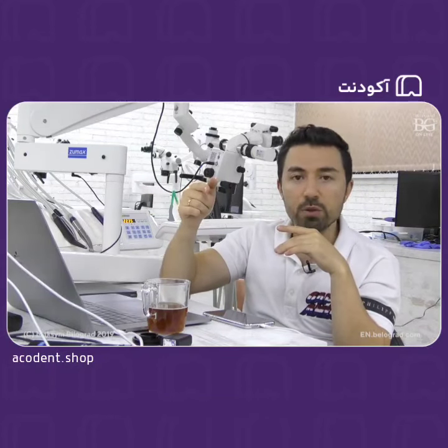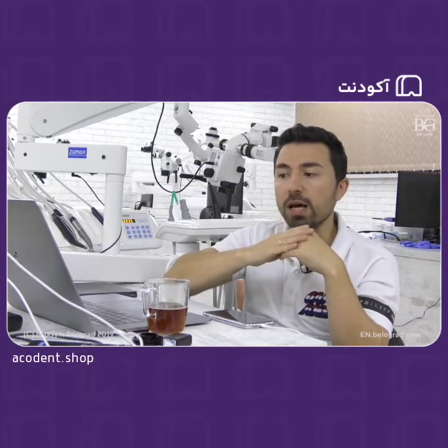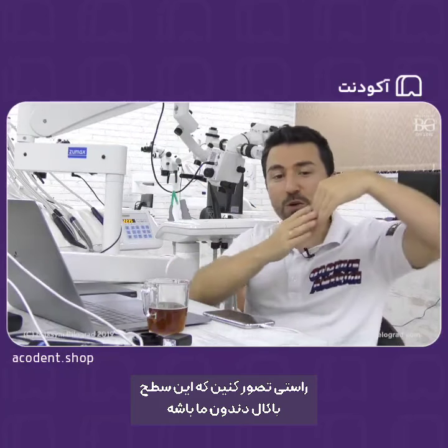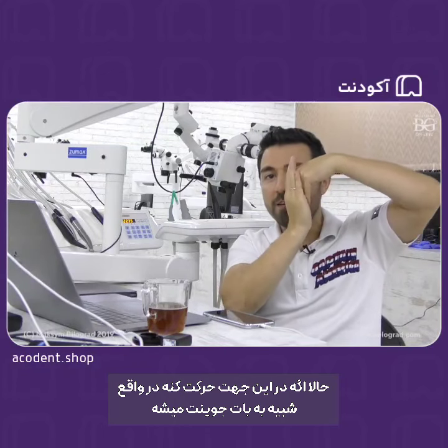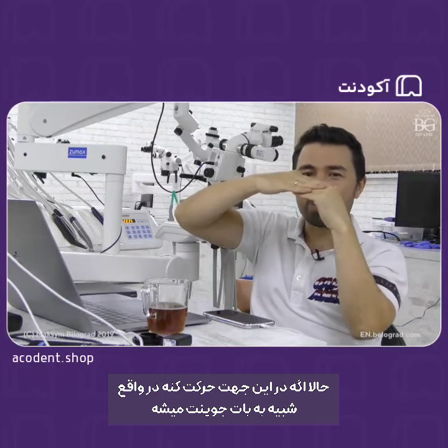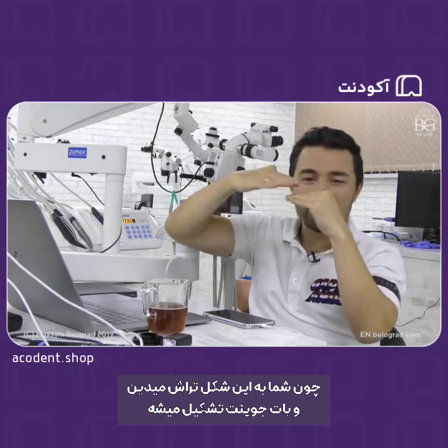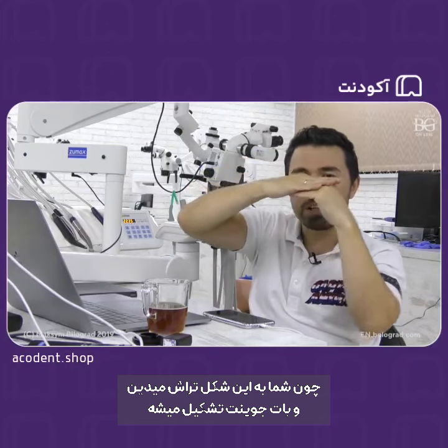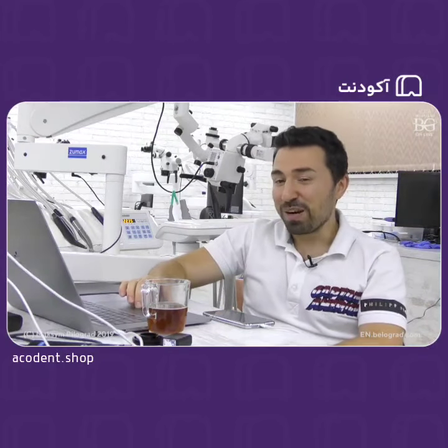Later on you will be able to get the recording and you can go back and see how this margin looks. And by the way, look, this is the buccal surface of our tooth. But if you move it like this, it's actually like a butt joint, because you prep like this and you have this ridge. This is a butt joint.